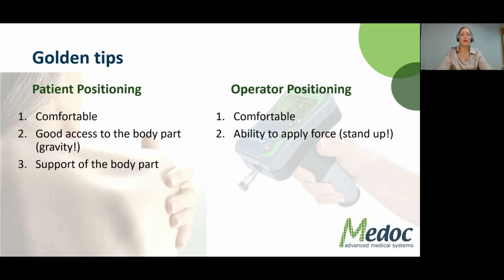Another important part is that the body part of the patient should be supported, preferably by a steady surface like a table or like an examination bed. I don't very much like to see people holding a patient's hand, for instance, and applying pressure with their other hand. This is a messy situation that can go easily wrong, and you will not be able to give a steady pressure over time. So I want you to have the hand supported on the table when you're applying the pressure. Not a minor point, but something that you have to keep in mind.